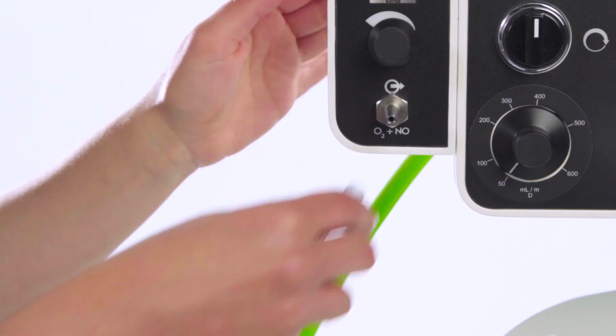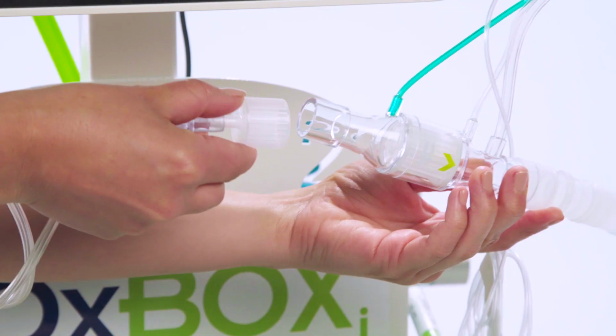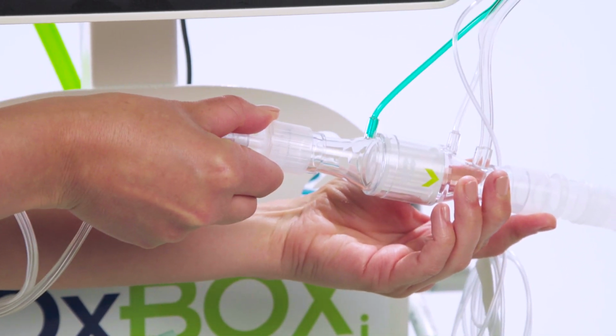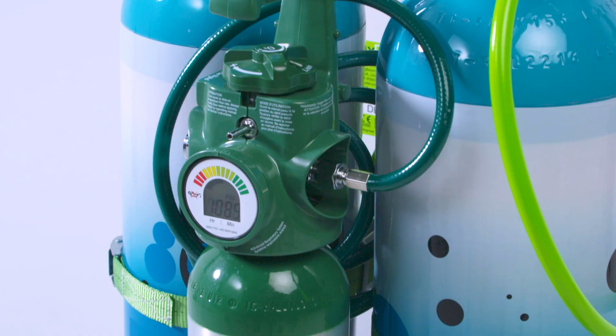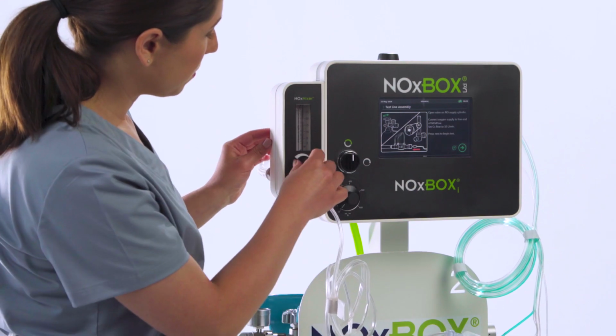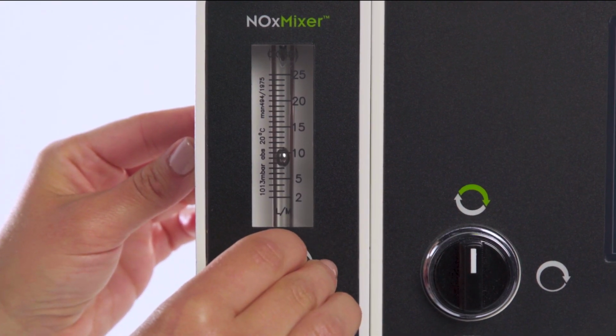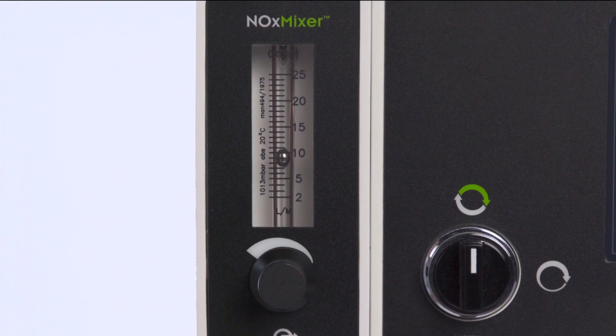Simply connect one end of the tubing to the NOx mixer outlet, and the other to the open end of the NOx flow as illustrated on the display. Make sure your oxygen source is connected to the back of the NOx mixer system and rotate the NOx mixer oxygen flow control counterclockwise to set the oxygen flow to 10 liters per minute.